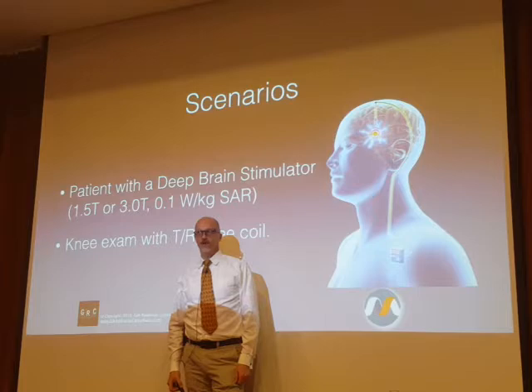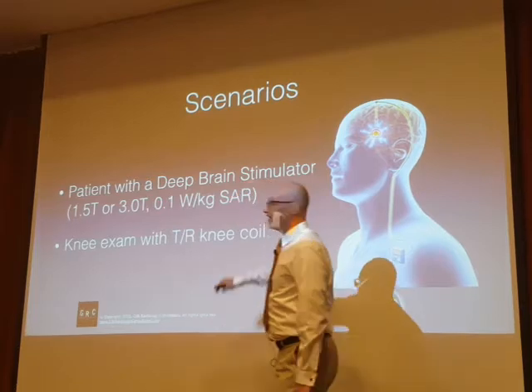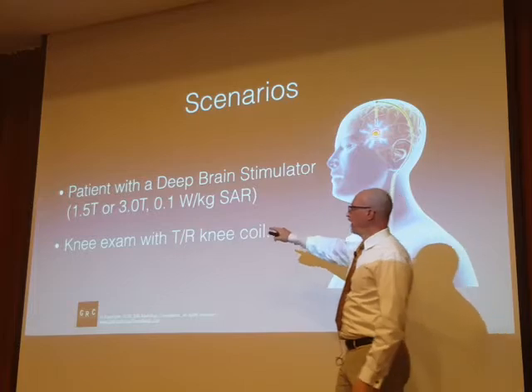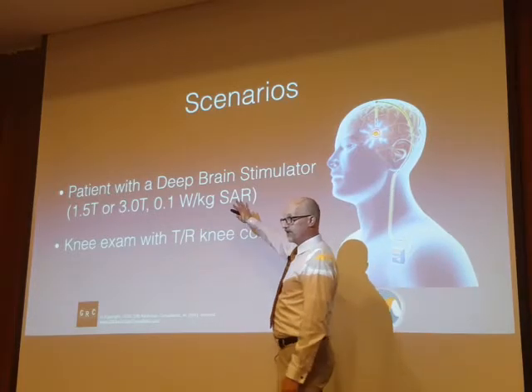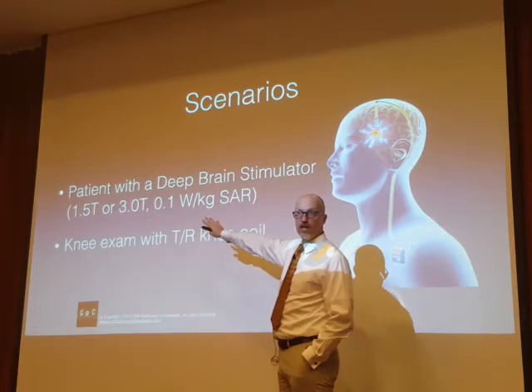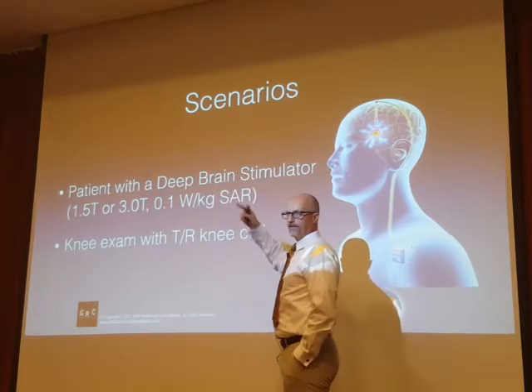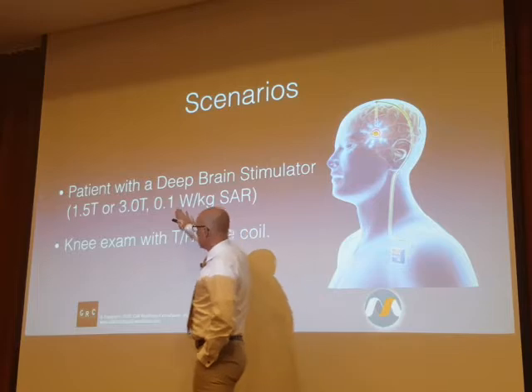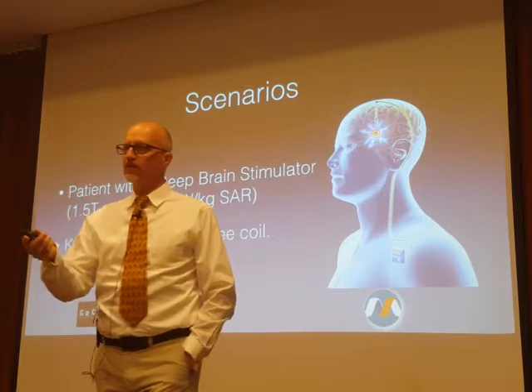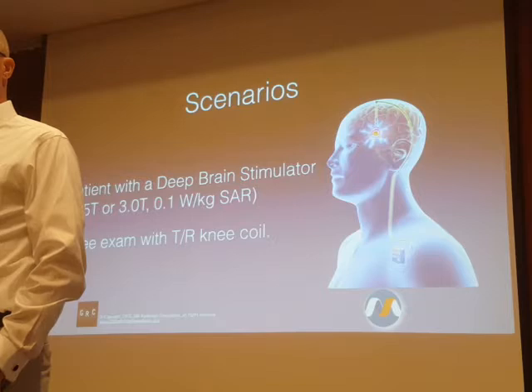I hear some very quiet no's. Yeah, people who are uncomfortable speaking out about this. In my opinion, no. We don't need to moderate the radio frequency energy at all. Is this off-label? Does this go against what the label says the manufacturer will stand behind? Absolutely it does. Do I feel that ignoring this limitation puts any additional risk on this study for this patient? No, I don't feel as though it does.